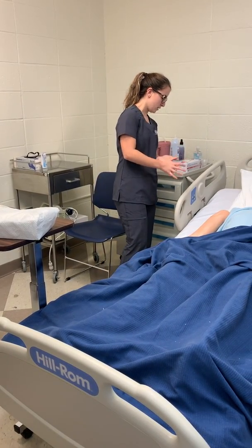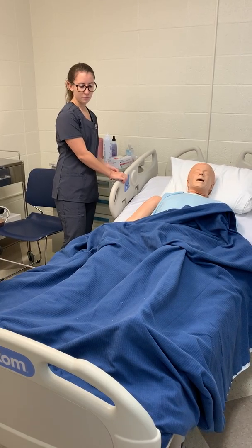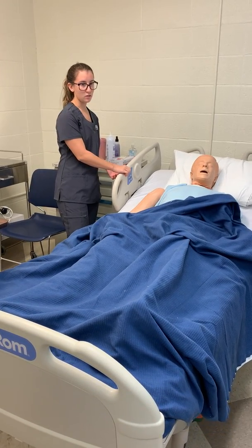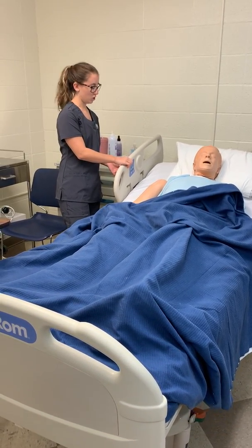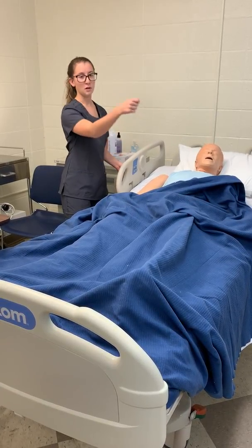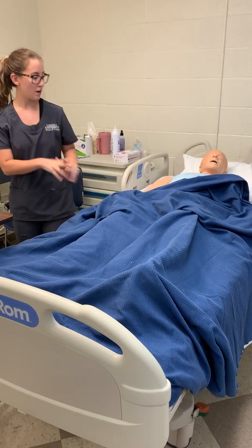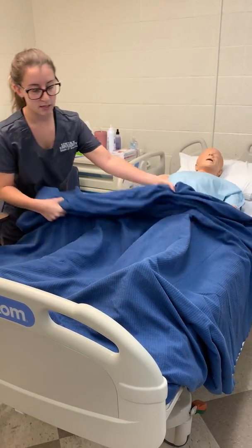and raise my bed to working position. And I'll lay her in supine position. And I've pulled my curtain for privacy as well. Alright, first thing I'm going to go ahead and do is lower her blankets down.